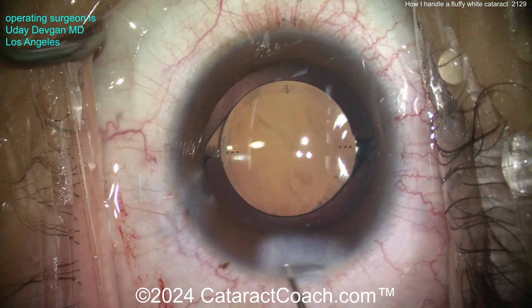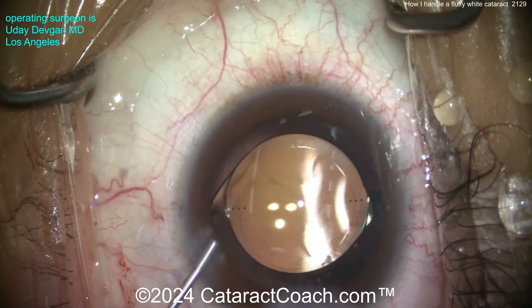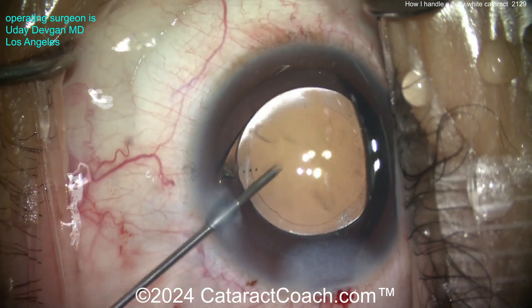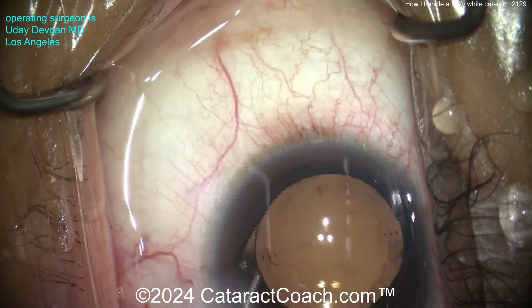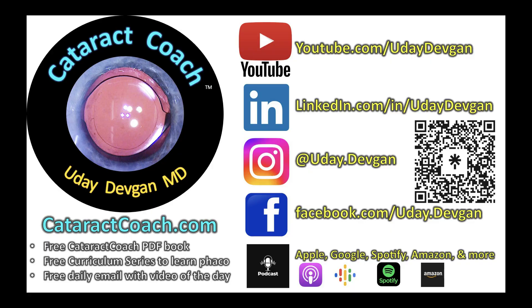This patient had a beautiful outcome — 20/20 vision on post-op day one, which is quite a feat given a totally white cataract. The lens is in really good position. Washing out any remaining viscoelastic, sealing up the incision — beautiful result. So keep this in mind: for soft white cataracts, be careful. And remember, we've got a free PDF book, the curriculum series, and an amazing podcast where we give away all the secrets of ophthalmology that you wish you knew.